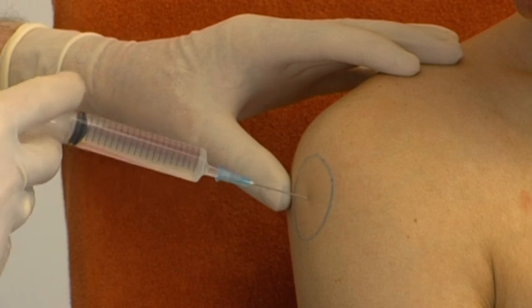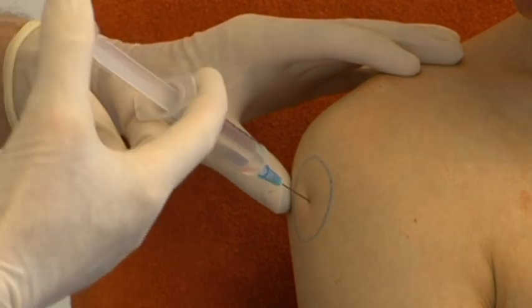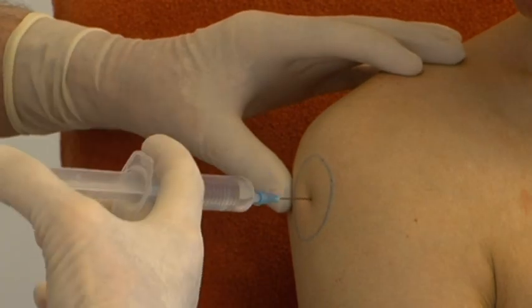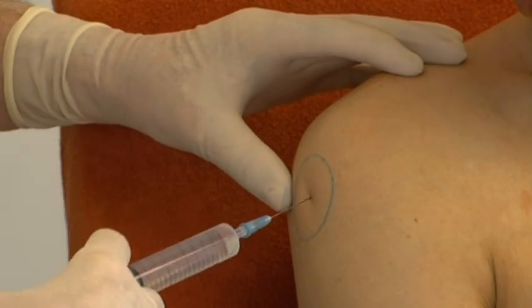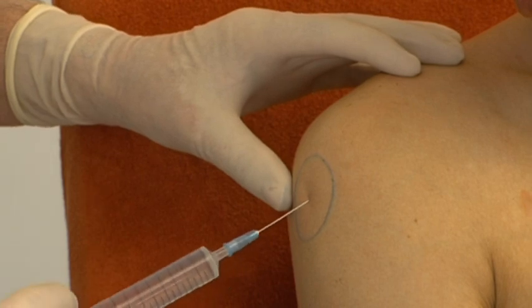Then, the fluid is divided over the entire painful area of the bursa by moving the needle in different directions.